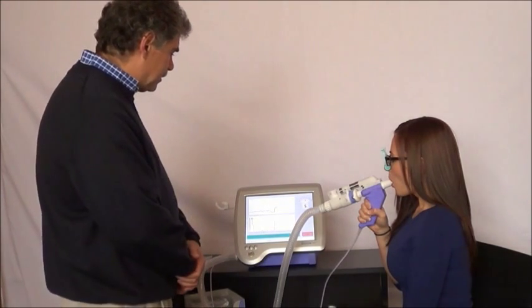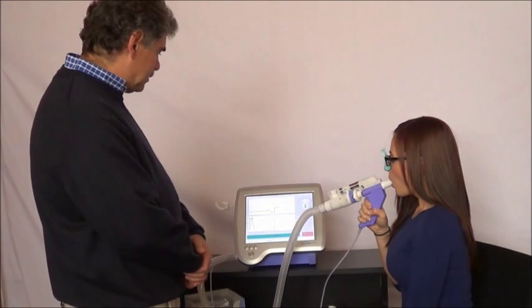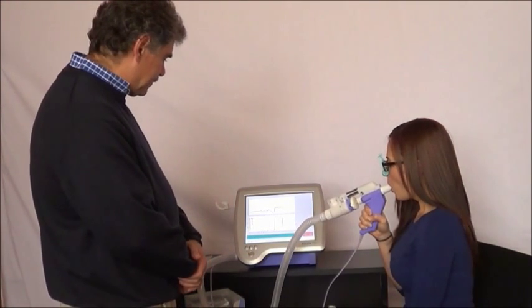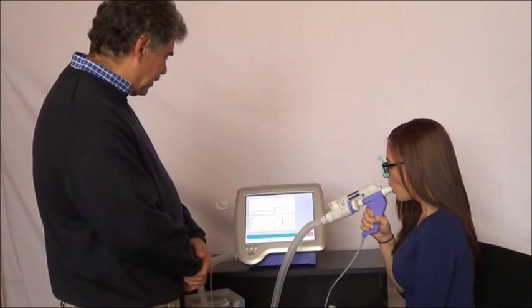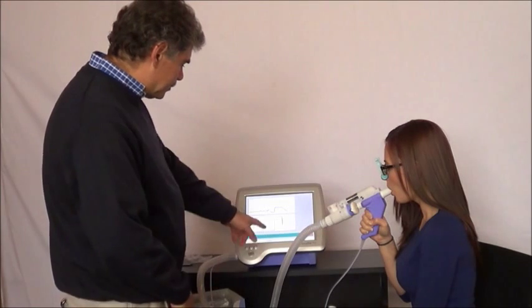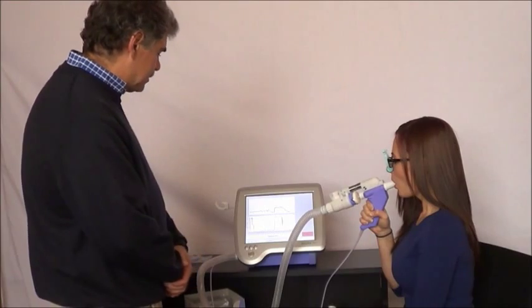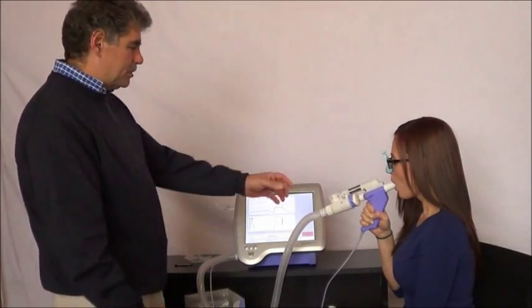Hold your breath until that clock counts down. Great — relaxed exhale, keep going, keep going. Again, once those curves drop off, I'm going to suggest you take a little inhale to end the test. Perfect. Good job.